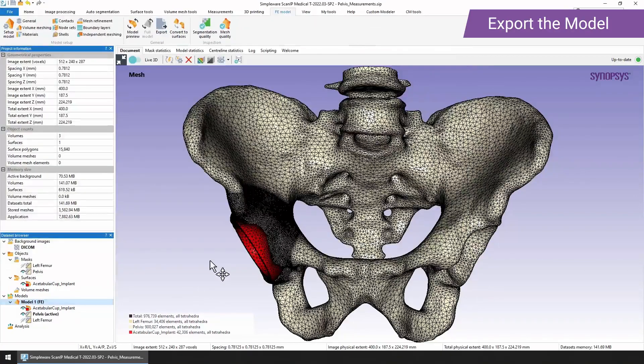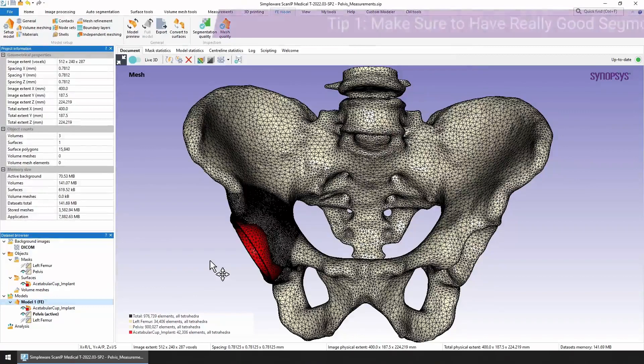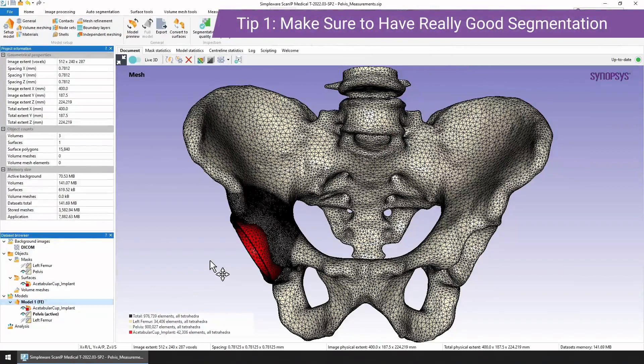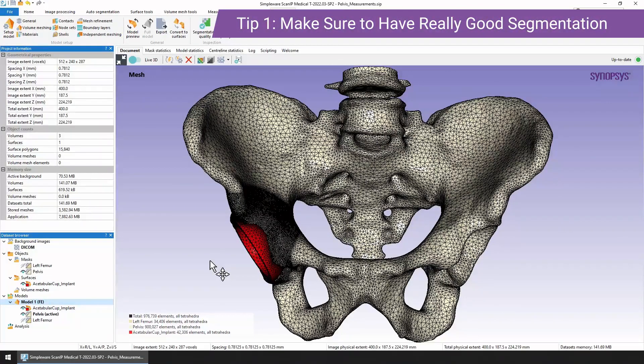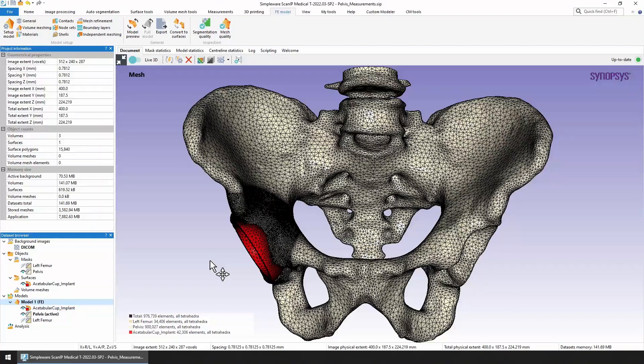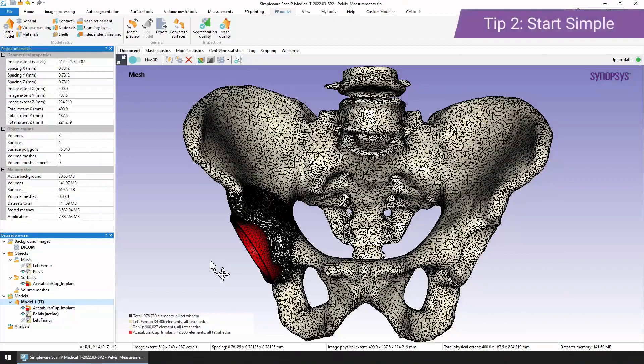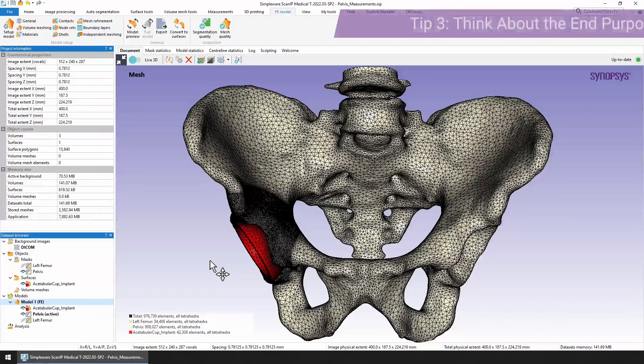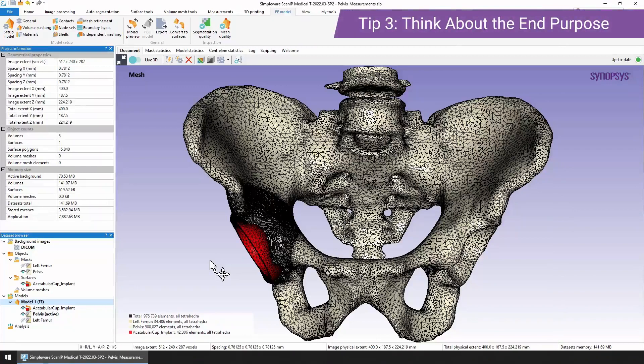Now I just want to leave you with a few starting basic tips. The first thing is to make sure that you have a really good segmentation. Check for floating islands and small cavities between your parts or inside your parts if you want solid objects. The next thing is to start simple. Try using the default options and then decide whether you need to decimate or add some more refinement into your mesh. And also think about the end purpose. These things can really help to reduce your element count while maintaining good accuracy within your model.